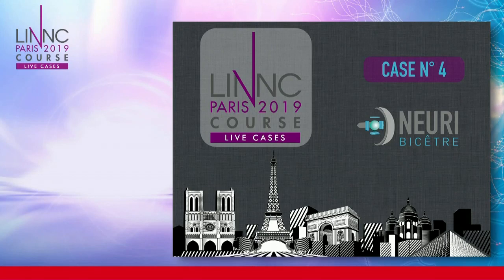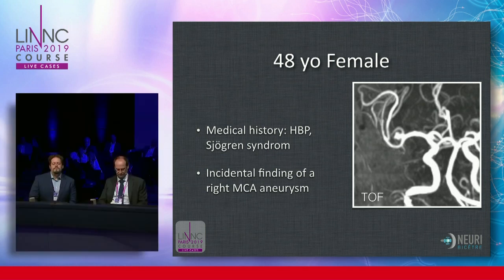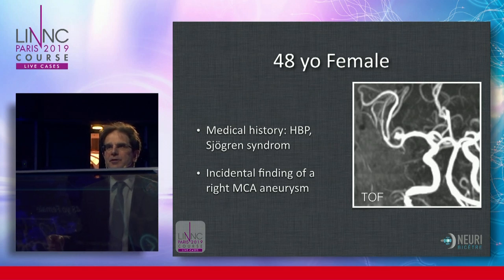So this is the fourth case of the day from Bicêtre, and then we'll go to Toronto. This is a 48-year-old woman. She has a very important past medical history with high blood pressure and Sjögren syndrome, which was really a matter of problem for this patient, especially for the general anesthesiology.